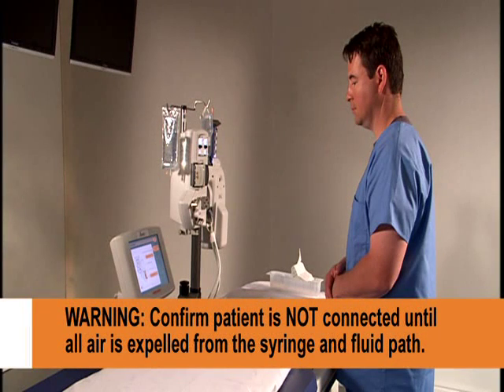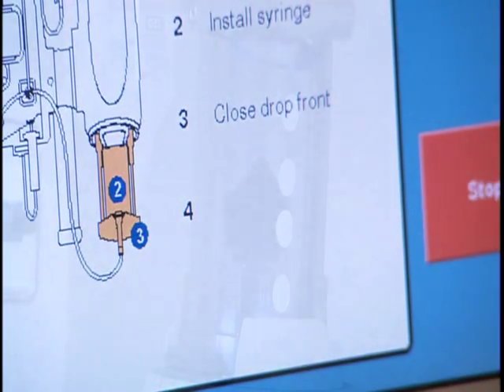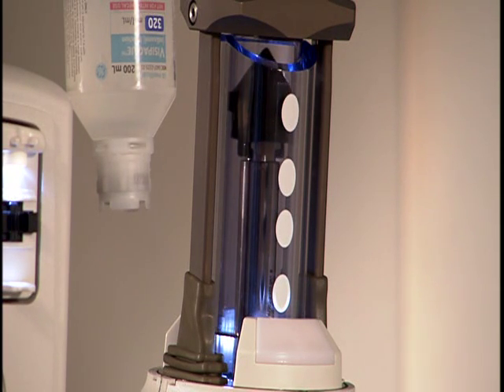At this point, it is very important to confirm that the patient is not connected. Touch Step 4, Engage Plunger. The system moves the piston to engage the plunger and pushes the plunger to the end of the syringe.